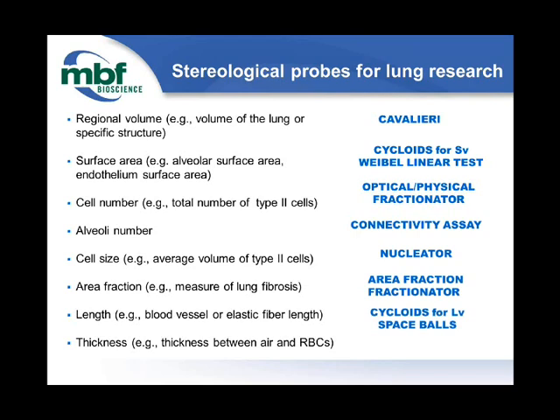You may be wondering about the blood vessel length or the elastic fiber length. Here's a couple probes, Cycloids for LV or Spaceballs, which can be used to estimate the length of strings, for instance, length of fibers.